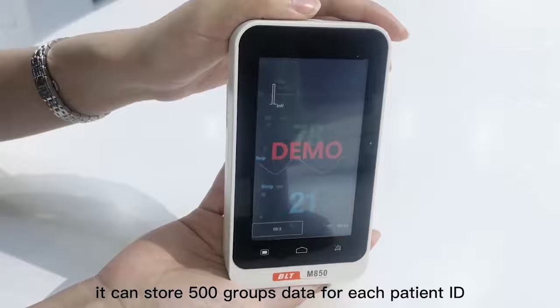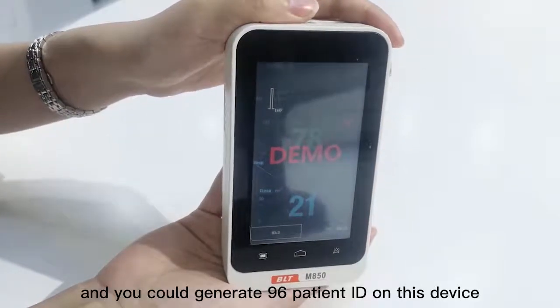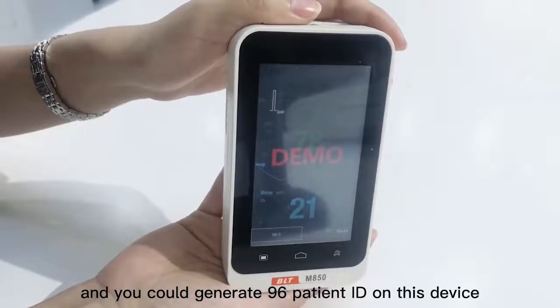Moreover, it can store 500 group data for each patient ID, and you could generate 96 patient IDs on this device.